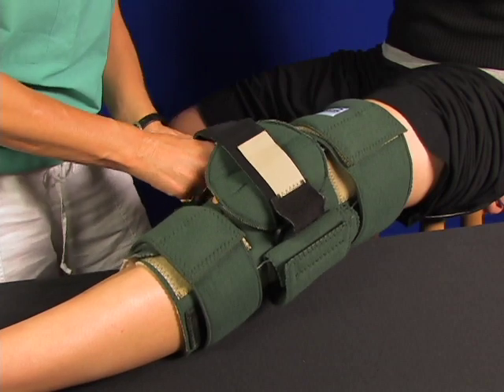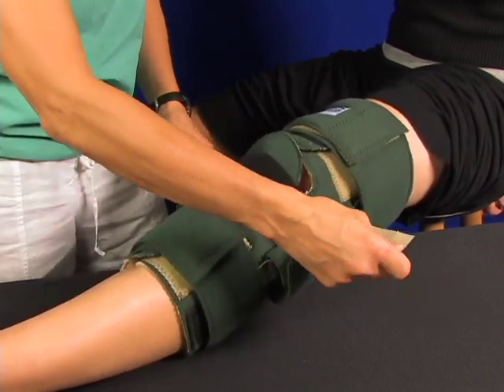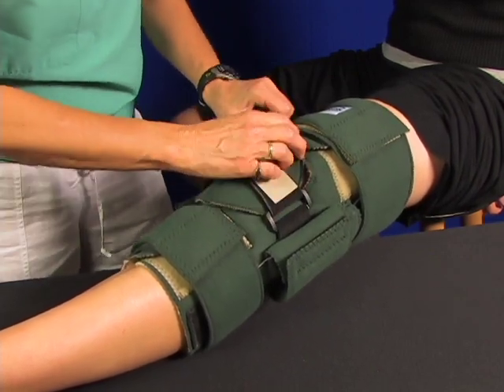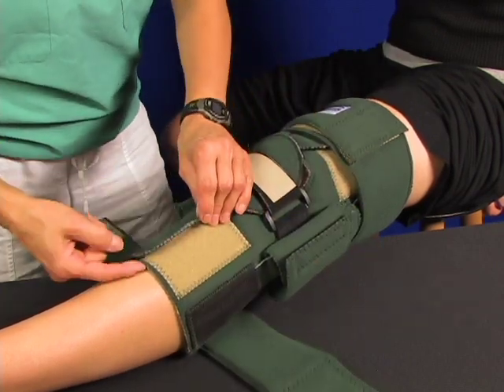The third point, patella pad, applies a third point of pressure, and you get some leverage based on the ties back to the hinge, close to the hinges.